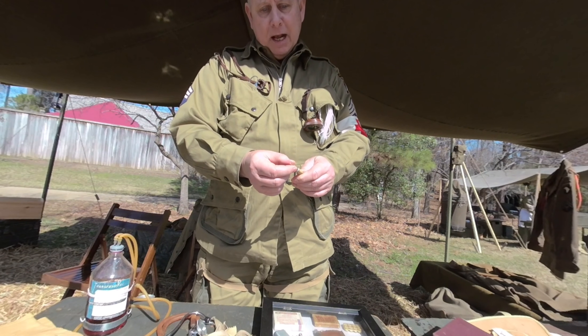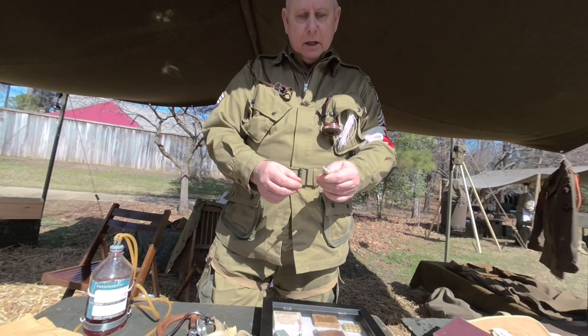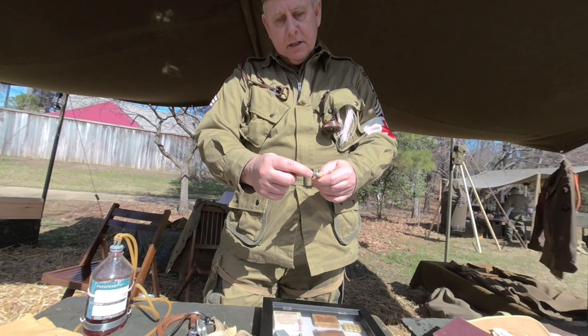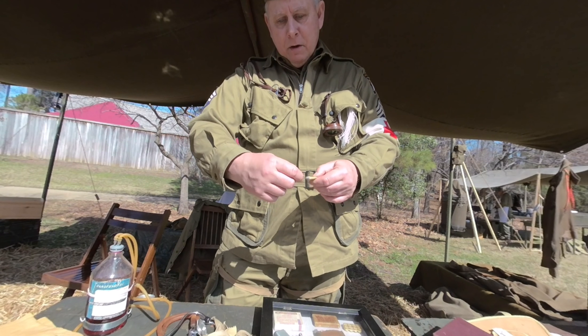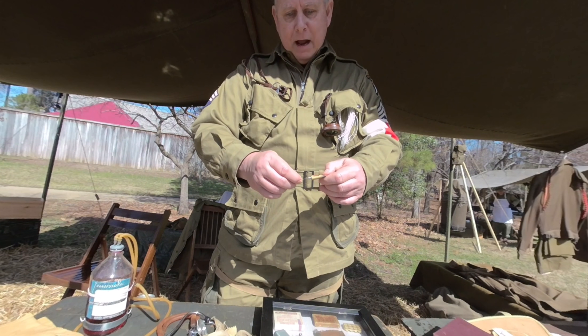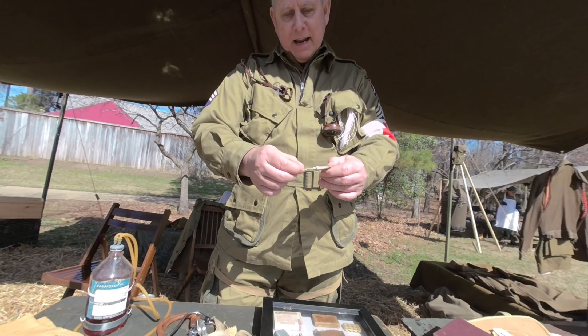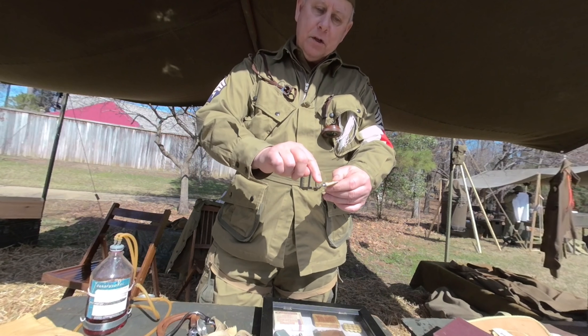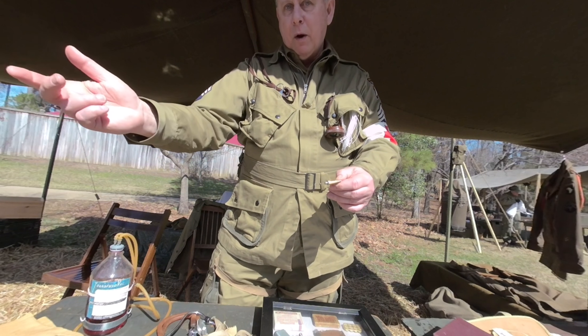It had a protective plastic cover, which you would pull off when you were ready to inject it. This is a small wire with a thumb protector that you would push down into the needle. This wire goes into the needle, and you want to push that down about an eighth of an inch because that's going to pierce the foil seal. Then you would take this part off and throw it away.